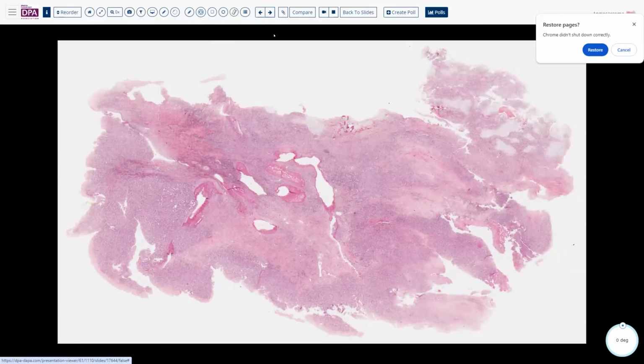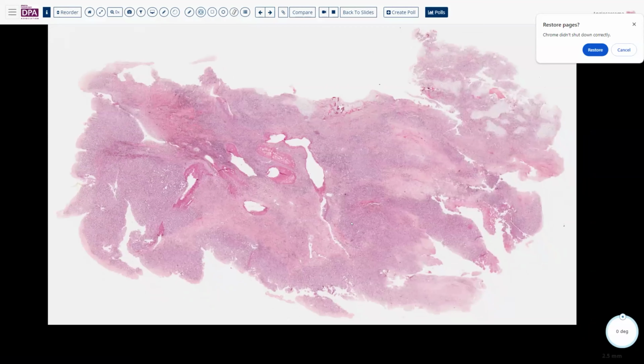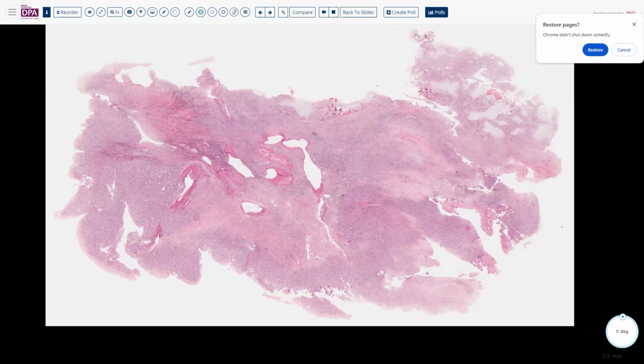Okay, well, let's delve a little bit further. We've just got a couple of minutes later. This is, again, one of those cases where I look at it and I go, I'm not sure we would make the same diagnosis today. This was a right atrial tumor in, I believe, a 90-year-old patient, or maybe it was an 80-year-old patient, an elderly patient, and obviously not compatible with life to have a mass lesion in your right atrium that's obstructing flow.